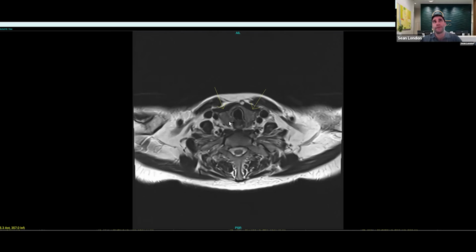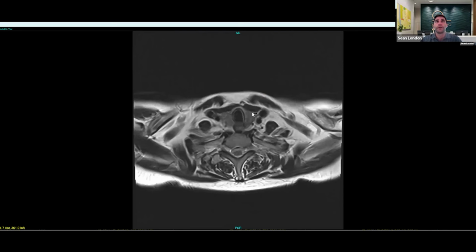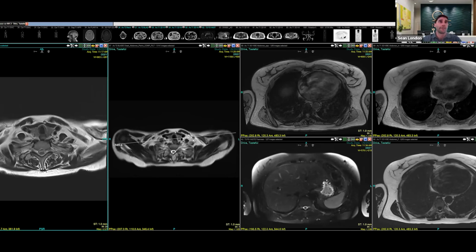I don't see any signs of a nodule or a mass, but I will say that MRI is not the best test to pick up thyroid nodules. That is, thyroid ultrasound is much more sensitive at detecting nodules, particularly when they have similar soft tissue structure to the background gland. They just don't stand out that well here. Obviously, if we do see one, we comment on them. But if you have a known thyroid nodule, it's best to be followed with an ultrasound. So nothing detected here. Next, we travel into the chest.